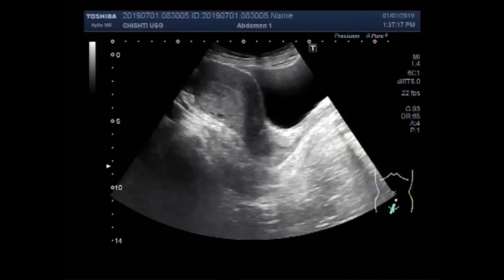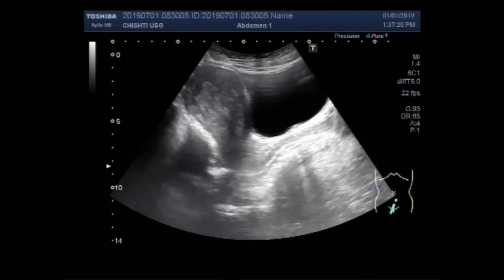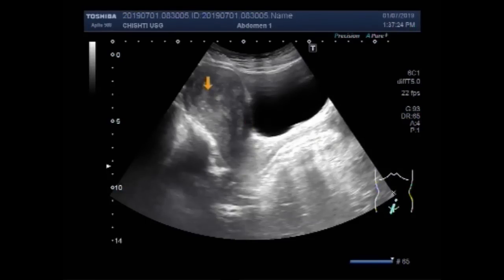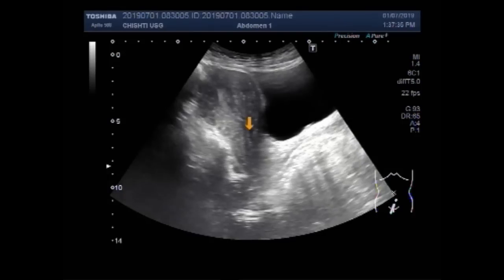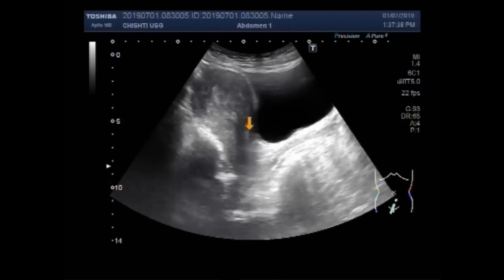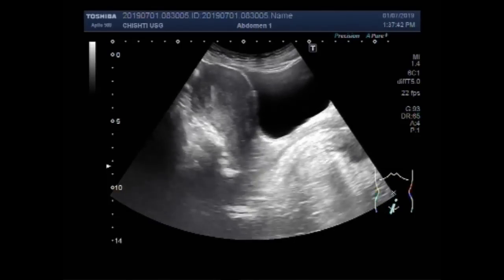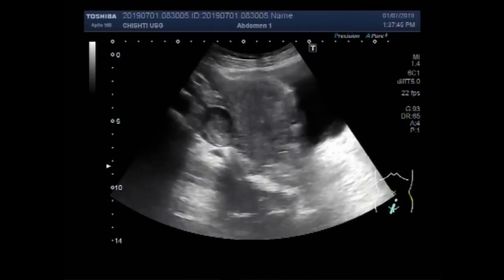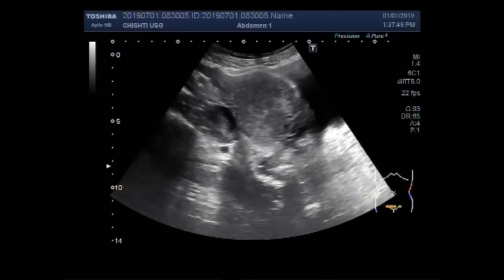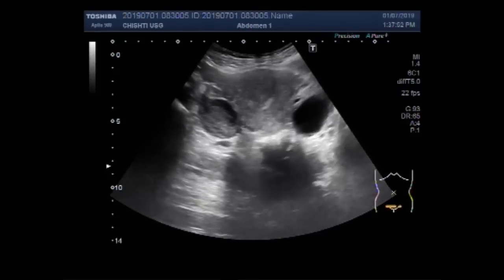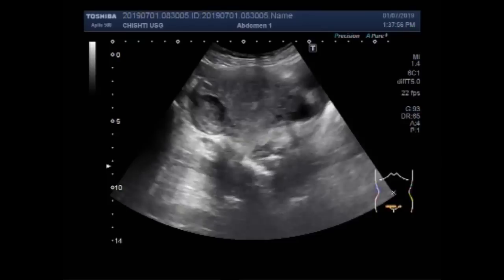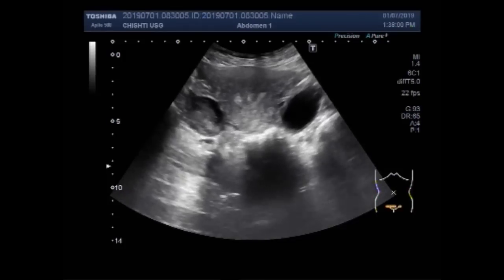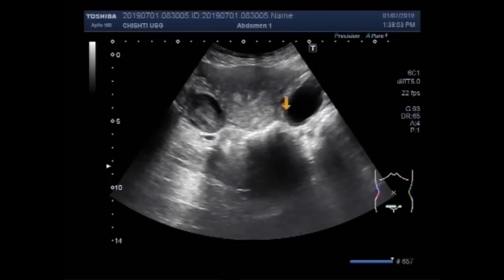Now you can see the uterus, urinary bladder, and cervix. You can see the uterus and both ovaries showing a mass. The right ovary has a cyst while the left ovary has a mass. This is the right ovarian cyst and this is the left ovarian mass.